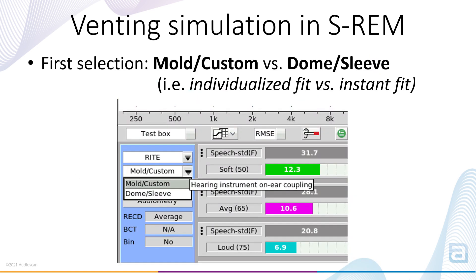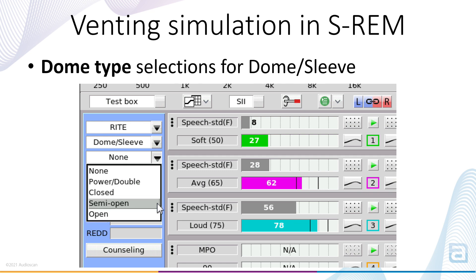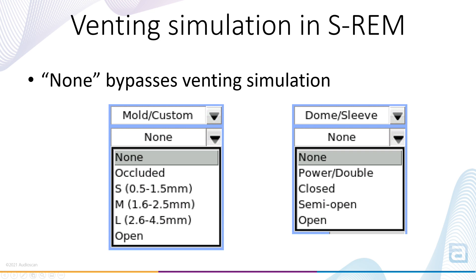In the first menu, the clinician chooses between mold/custom and dome/sleeve. If mold/custom is selected, the second menu provides a selection of vent sizes for custom products or those which use a custom ear mold, such as a standard BTE. If dome/sleeve is selected, the second menu provides categories of instant ear tips. In each case, the appropriate predicted venting effect is applied during the subsequent measurements. In both venting corrections menus, the none selection is provided to allow the bypassing of the corrections entirely and ensure measurements equivalent to those from previous software.